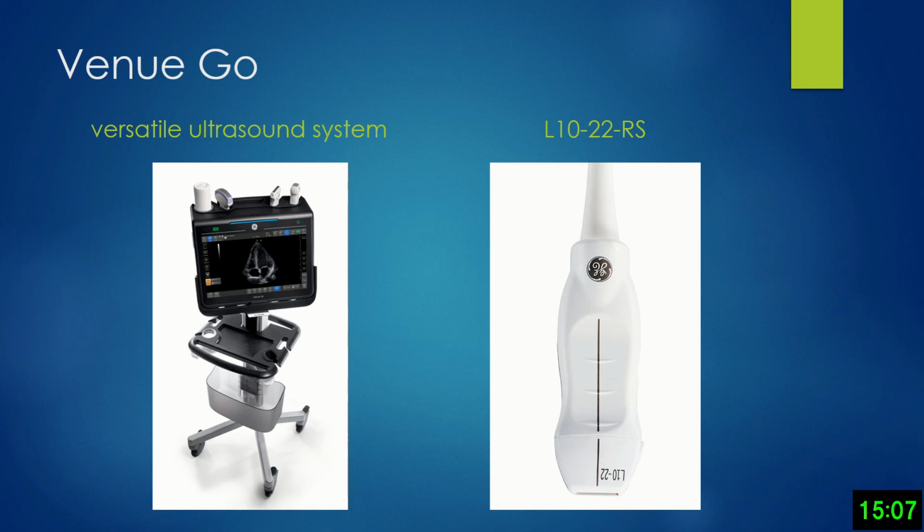Next, I would like to provide a brief introduction to the ultrasound system introduced in my hospital. Venue is a versatile ultrasound system. This machine is also capable of performing cardiac echo examinations. The probe holders are at the top of the screen to prevent the probe cord from coming into touch with the floor.